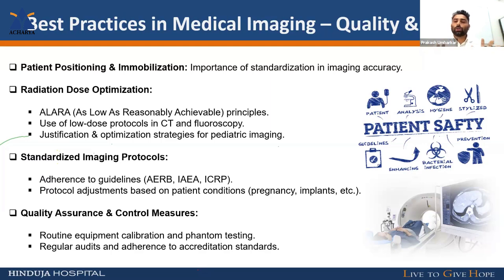We want quality of the treatment, but we also want quality of the equipment. So always routinely check your equipment on a daily, weekly or monthly basis. Check whether it is performing weekly and giving properly good quality images. Check every parameter according to your institute protocol. That can also help regulate the standard of the imaging procedure.